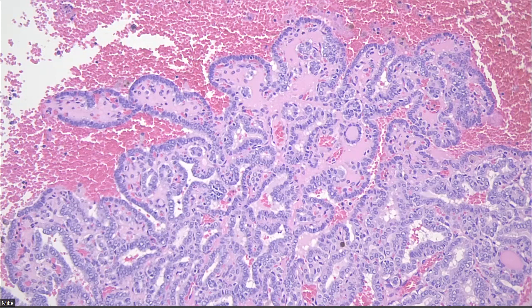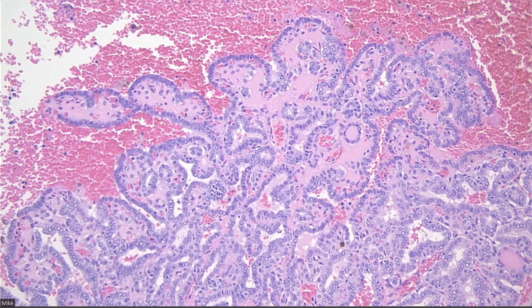Because I think what we think about thyroid is just being blown out of the water, because papillae don't matter, nuclei don't matter, right? What matters is the underlying molecular soul of these things. And we can't see the molecular soul because there's so much overlap.